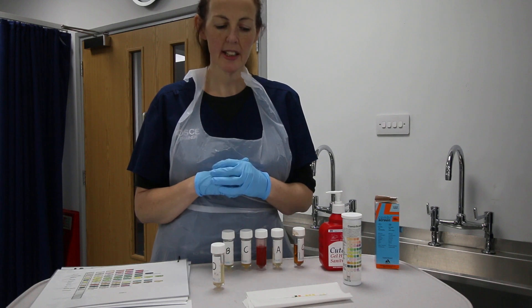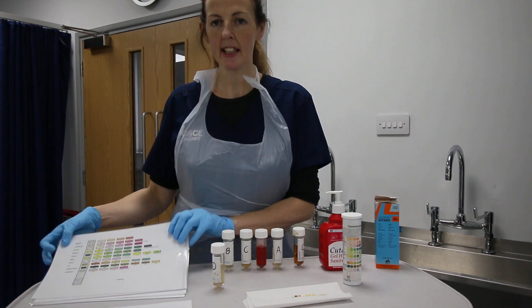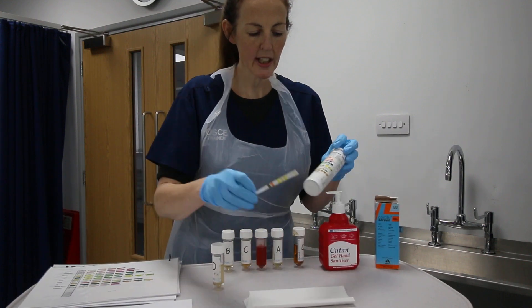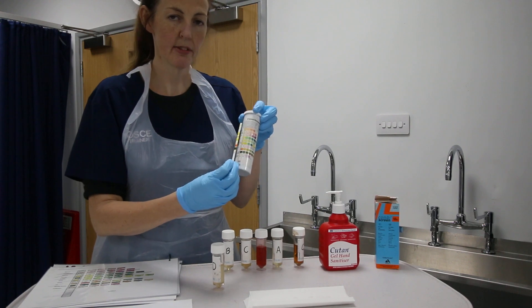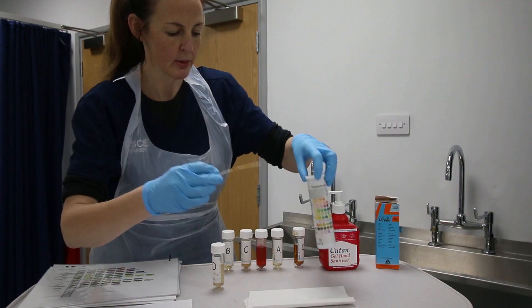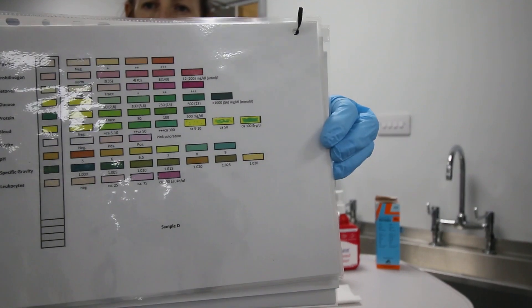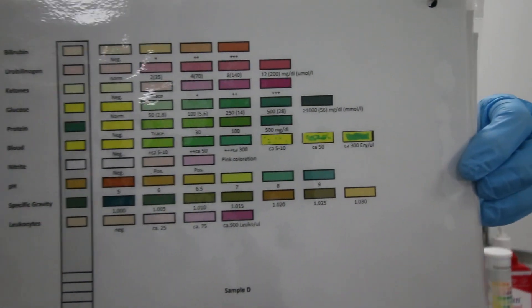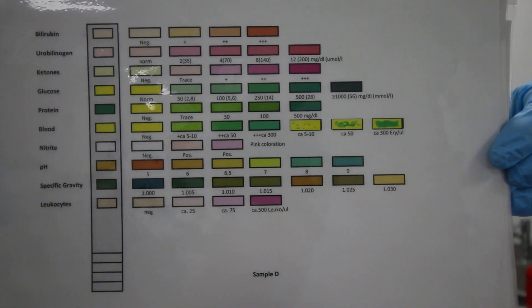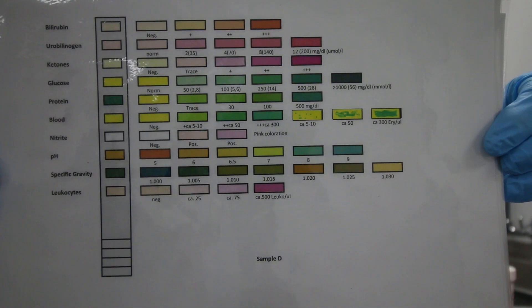I'm counting down my two minutes — I'm going to pretend the two minutes has elapsed. To make it easier to see, after the two minutes I'm holding my strip against the vial. You notice that the marker for protein, which is in the middle, has illuminated a dark green colour — that means there's protein in my urine.